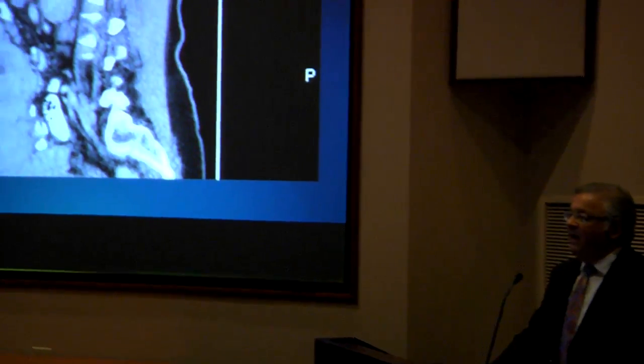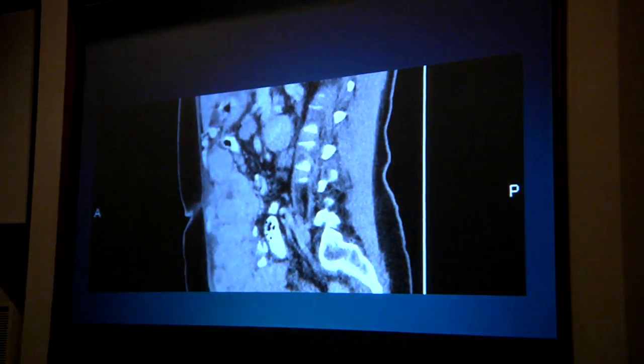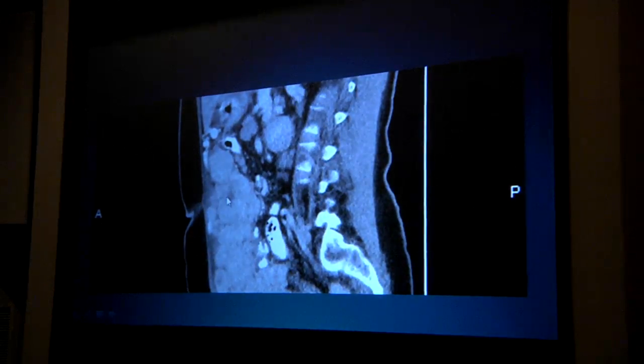Focal disease manifestations, bulky disease is not a problem, and I'm going to show you examples of bulky disease. You don't need to be a radiologist to look for bulky disease. This is where the action is. Individual or multiple nodules, low volume disease is our greatest challenge, especially in a patient who has positive tumor markers, who is doing well, and who, for example, may have a CT scan that is normal, and we're really trying to figure out better what's going on in terms of identifying measurable disease.